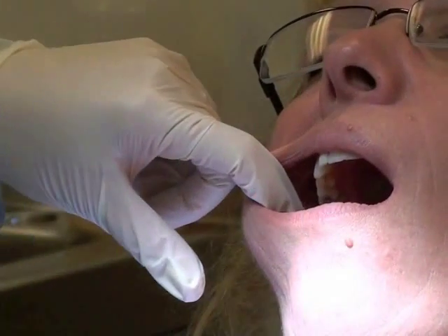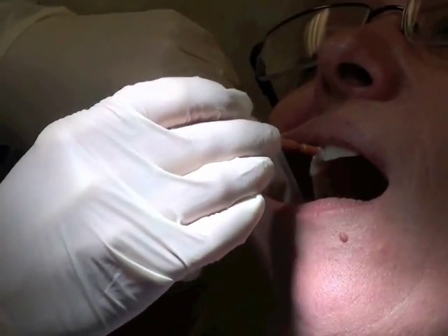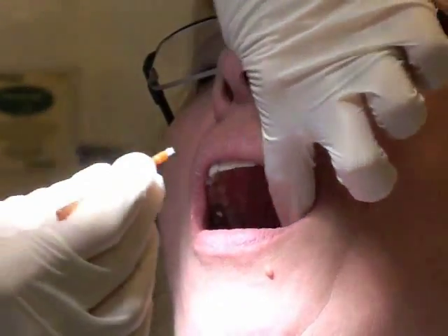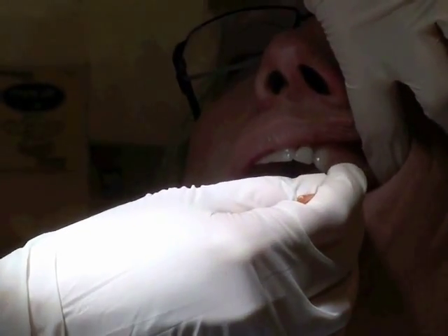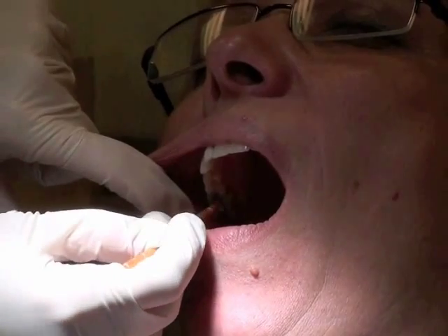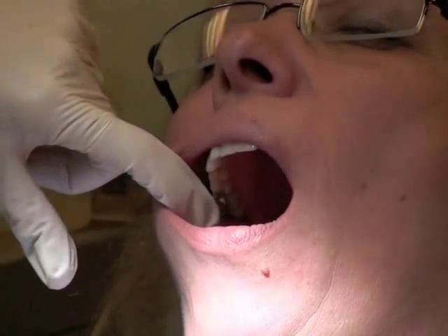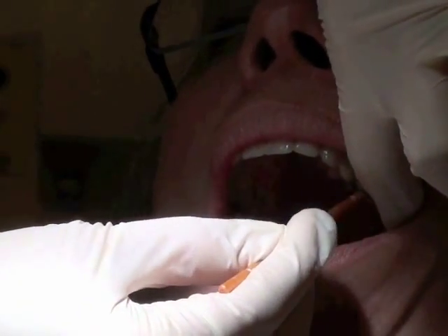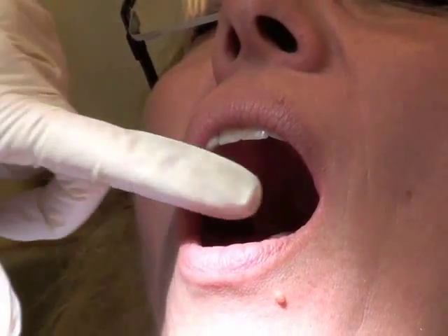I'm going to open the package and apply it to the applicator, and I'm just going to sweep it across the facial surfaces of the teeth, as well as the occlusal surfaces. Do that for both the maxillary and the mandibular.